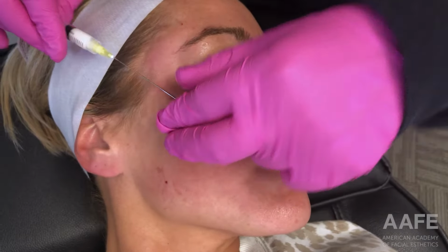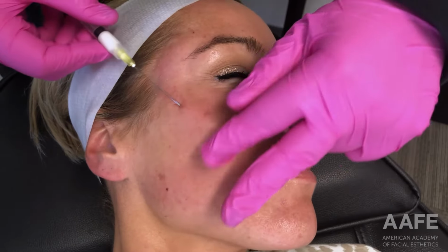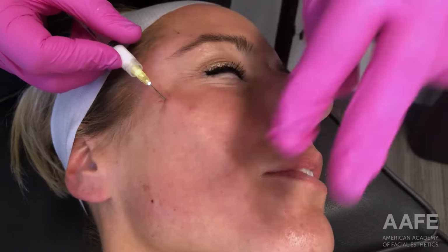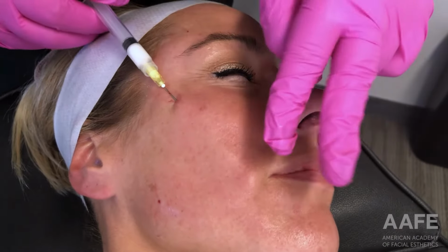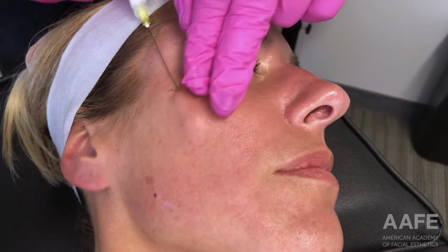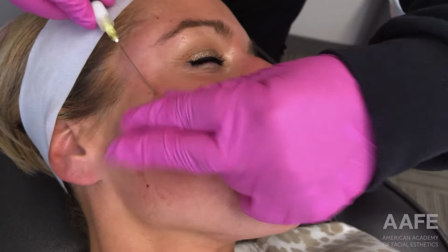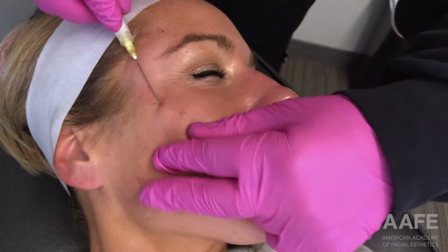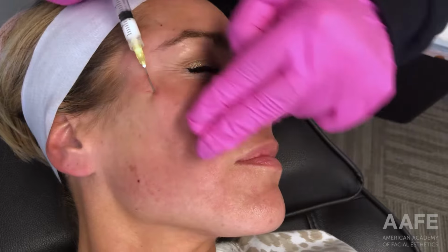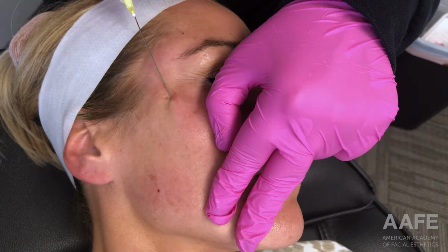That's the beauty of aesthetics, is that every patient requires a different treatment plan because we all have varying anatomy and our goals are different and our deficits are different. And so, the Hyperdilute Radiesse really allows a lot of flexibility for you to create a treatment plan that you think will best address the patient's concerns. And for this particular patient, overall, she is needing stimulation of some collagen throughout her entire face, both upper and lower. Despite her being young, she has lost a fair amount of volume. And so we hope to restore volume and slow those signs of aging over time.